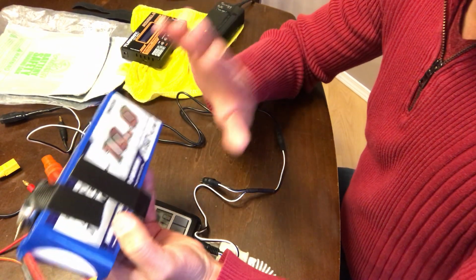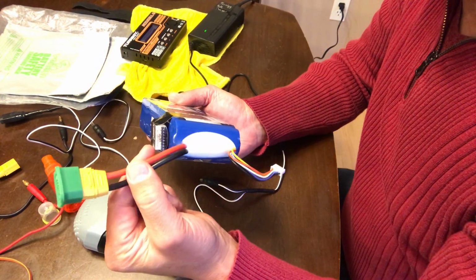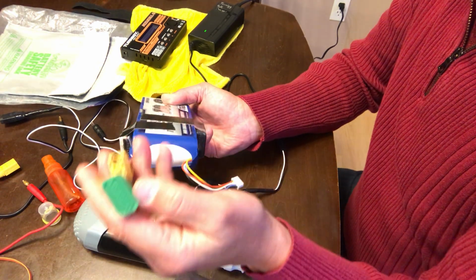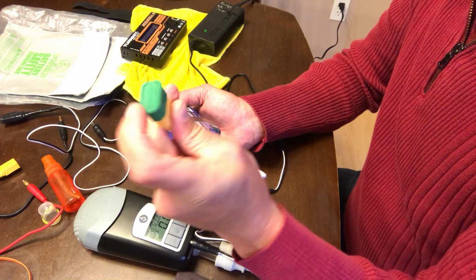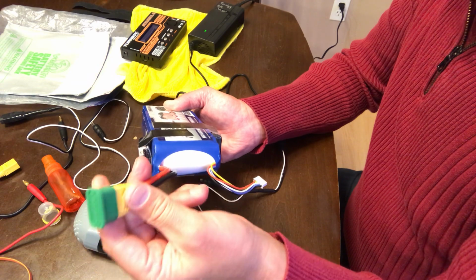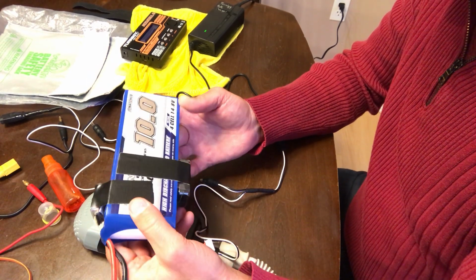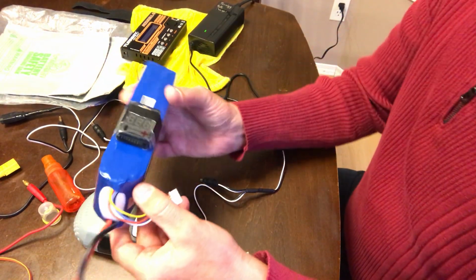Anyway, so this battery is quite cool because it comes with the main power supply, right? You're going to get this XT90 connector on this particular battery, but you can get adapters and stuff that you need, and little plug covers, which I also bought just to let you know when it's charged or not. But basically to keep water out in case you're backpacking and it slips into a stream or something like that.